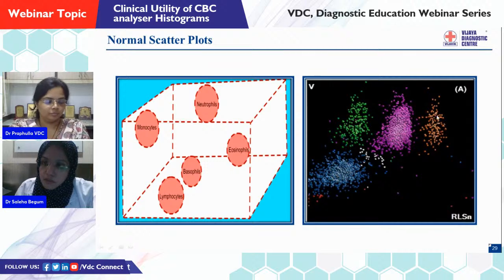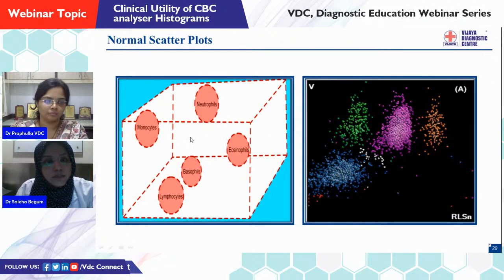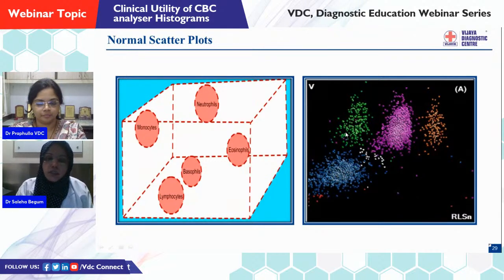The orange population here you can see is eosinophils, and neutrophils occupy a middle and upper position, like how you are seeing the purple color population here, and monocytes occupy the extreme left of the scatter but above the lymphocyte population. So here you can see the green color population is represented as monocytes in the scattergram.